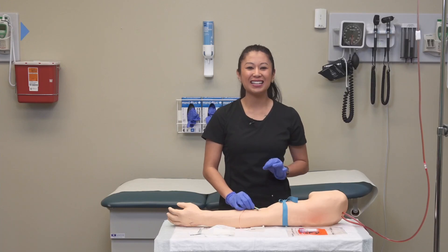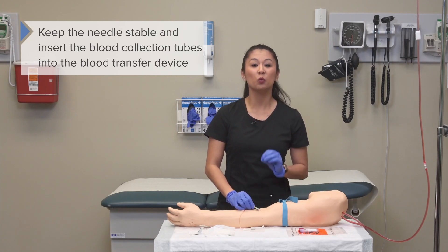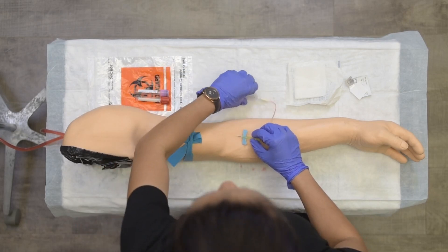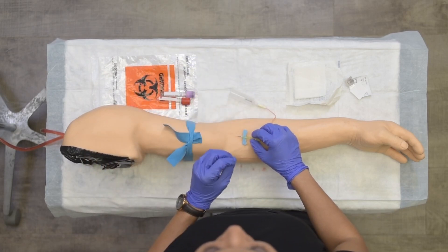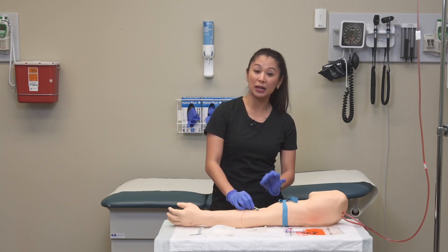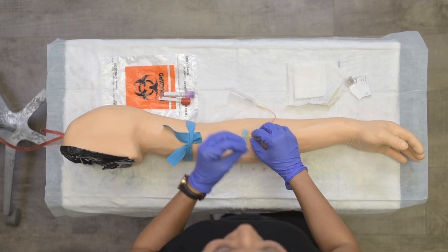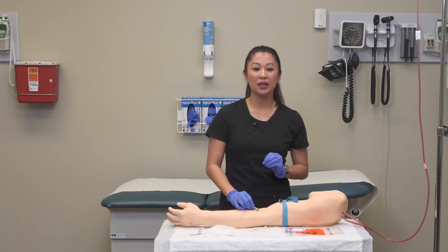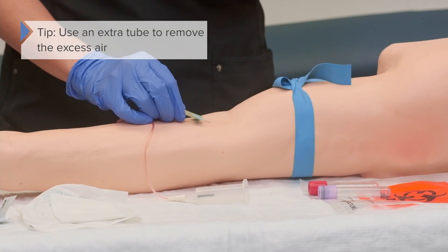Once we've been successful in accessing the vein, do your best to keep the needle as stable as possible with your dominant hand. Then use your non-dominant hand to insert your blood collection tubes into the blood transfer device. I used a butterfly or wingtip needle — sometimes because of the extra tubing, there can be air that gets in. We do not want this in our lab sample, so it's a great idea to use a waste tube to remove the excess air.